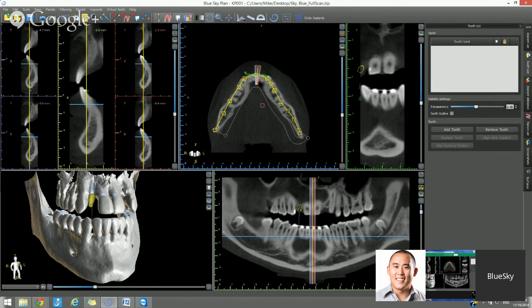It's not recommended to make a surgical guide based on the CT scan. Okay, it's recommended to do it based on a model scan. There are a couple of reasons for that. One is there's no scatter in the model. And connected to that is that there's no density threshold regarding STL files.